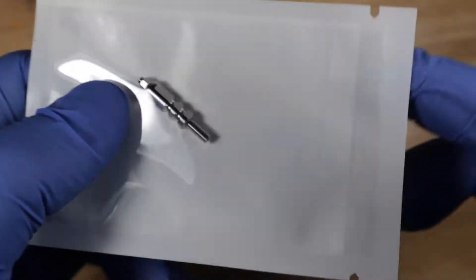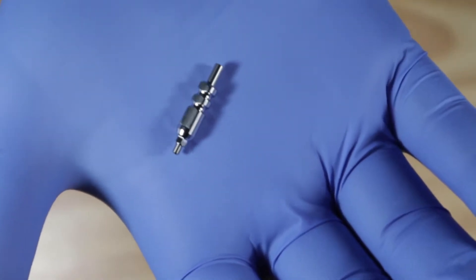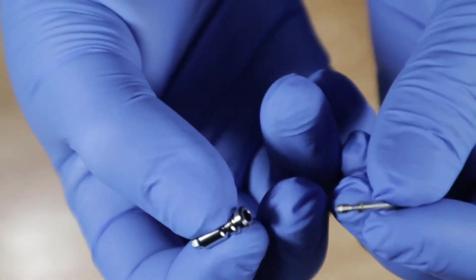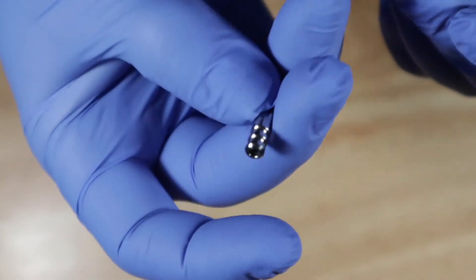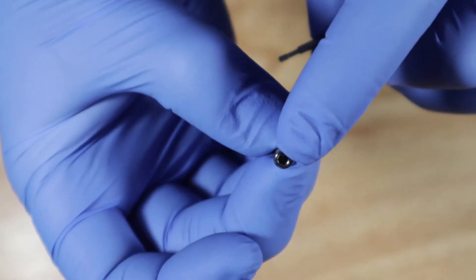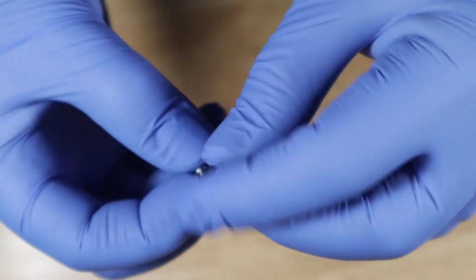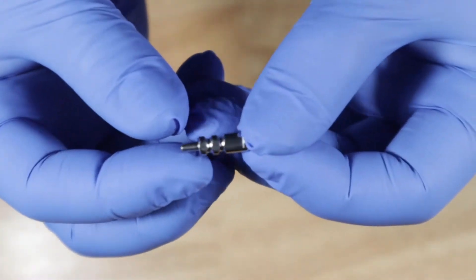The open tray impression coping — you might be wondering how this little part even works. So this is what the impression coping looks like: it's made up of two parts. Let me remove the screw to show you. This is the actual impression coping — the part that goes onto the implant — and this is the screw. The screw is really long so it can stick out through the impression material and you'll easily find it. I'm going to put them back together and show you how to take an impression.